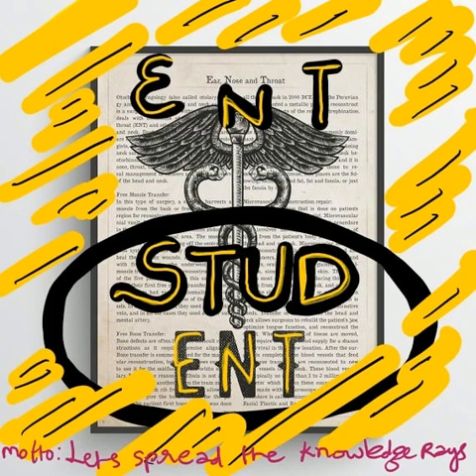Using a large, short shaft cutting burr, the cortical bone of the triangle is removed with continuous irrigation. Mastoid cortex is opened systematically with wide saucerization and rounded edges, delineating the tegmen plate superiorly by removing the peritegmen air cells, the posterior meatal wall anteriorly, and the sigmoid sinus posteriorly by exenterating the perisinus and retrosigmoid air cells.